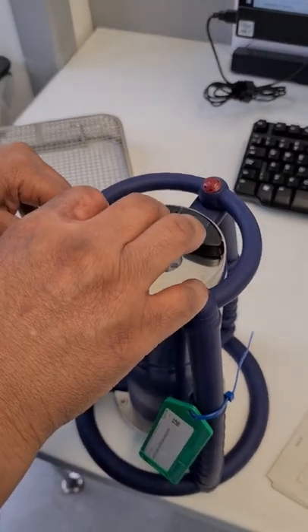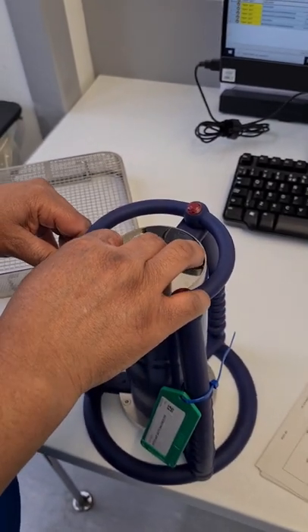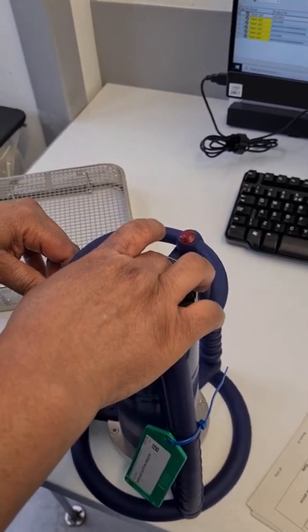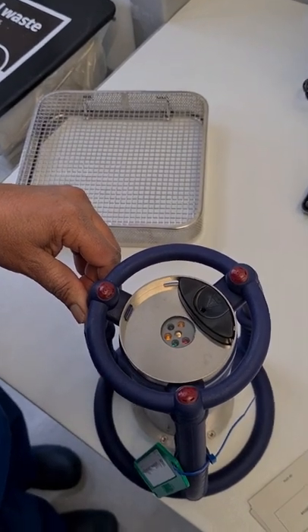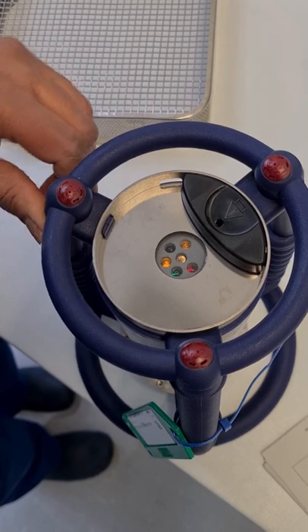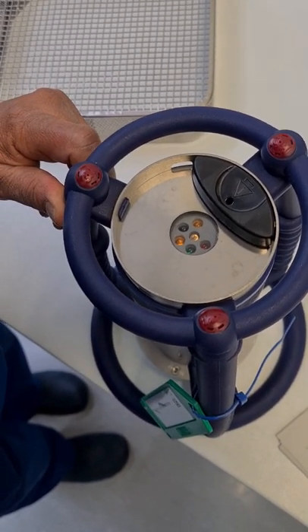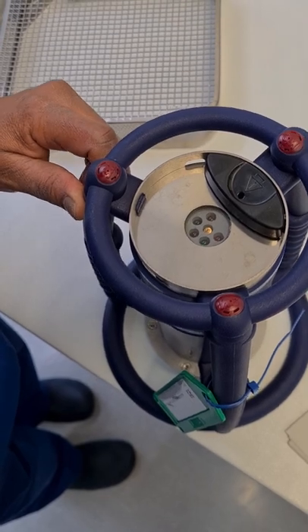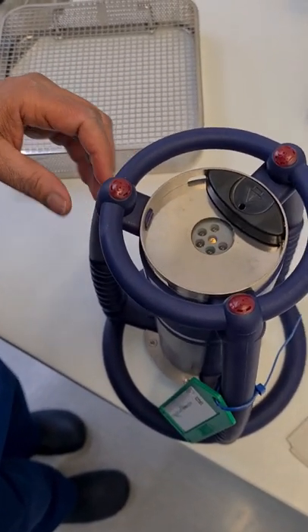Now I'm going to pull out the ETS machine. I pull it once, then I leave it, and I wait for the green light or the amber light to beep. I now have the amber light beeping, which means it's ready to go into the autoclave.